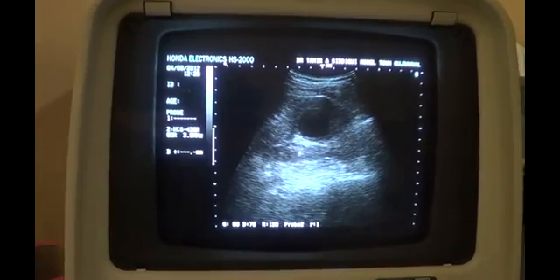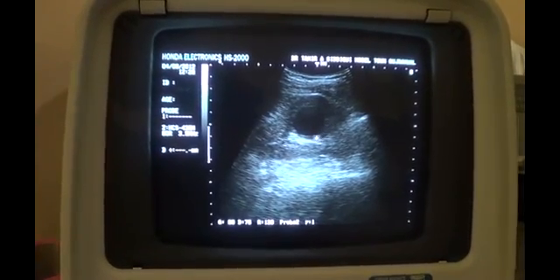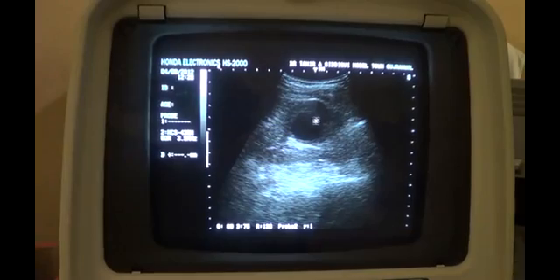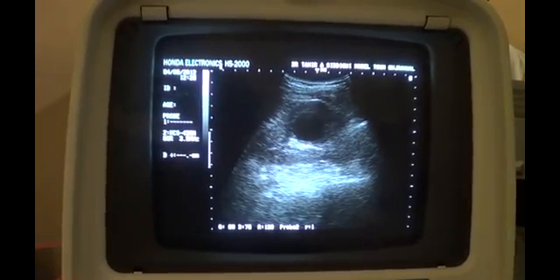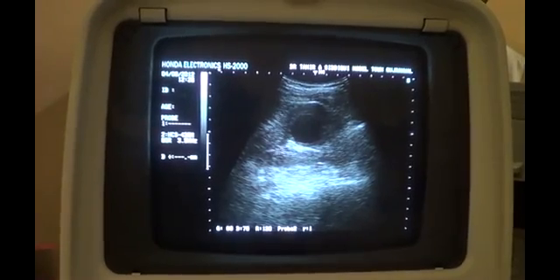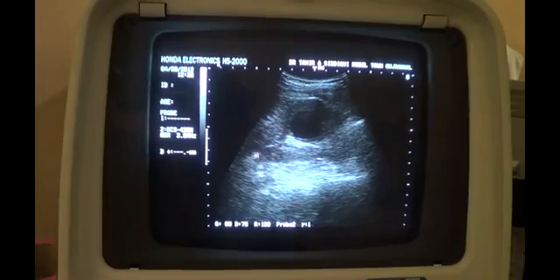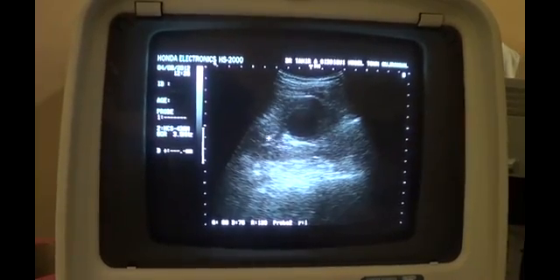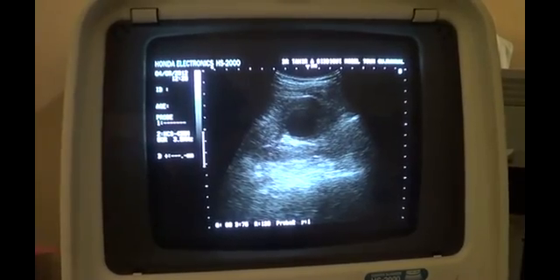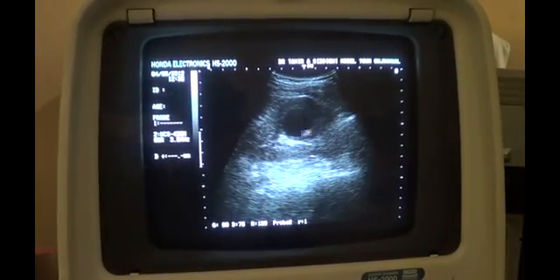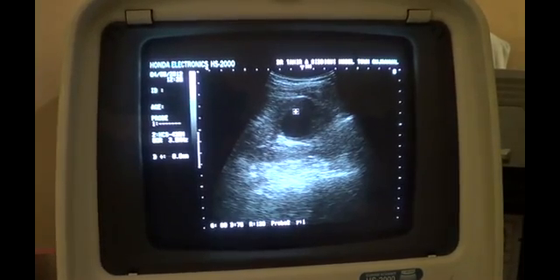That is the reason we don't get posterior wall enhancement as we get in simple cysts. Now you see that this cyst is not in the cortical region; rather it is in the medullary region. This is the cortex, and this is the posterior cortex. This is the central sinus echo complex, and the cyst is in the medulla — cysts here are called medullary cysts.